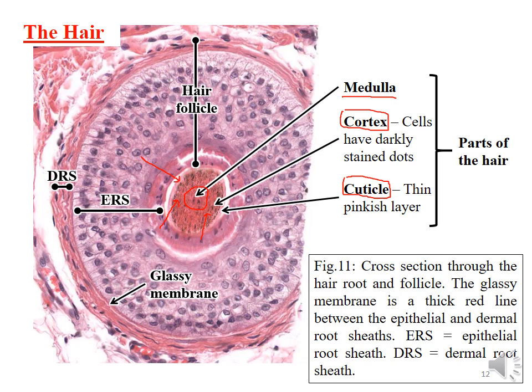Now these are the parts of the hair. What about the hair follicle? The hair follicle is formed first of all of an epithelial root sheath, formed from cells that are derived from the epidermis. As you know from your lecture, it is formed of internal and external root sheath, but we are not going to go into these details in the lab. So the cellular part here, the first part of the hair follicle, is the epithelial root sheath.